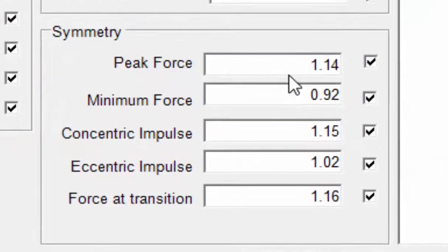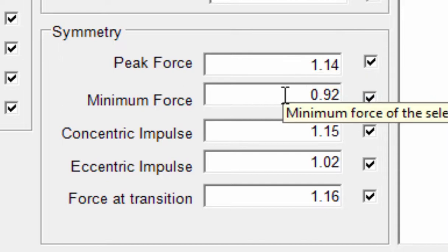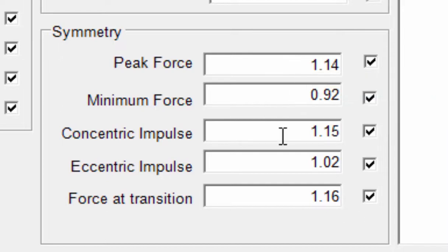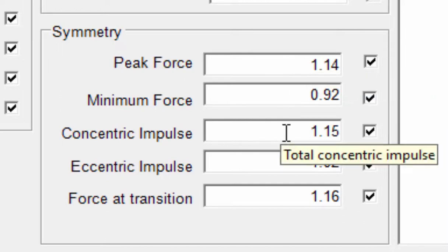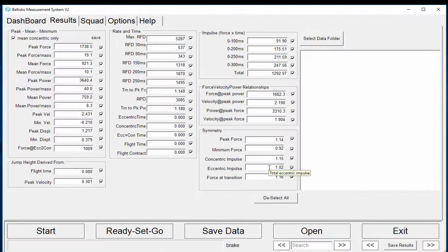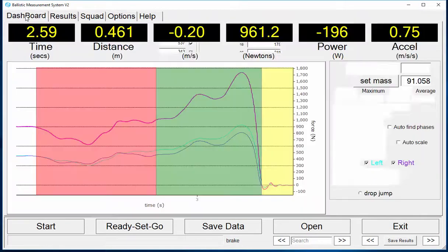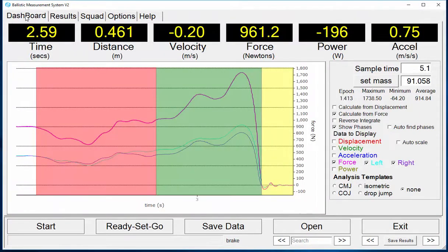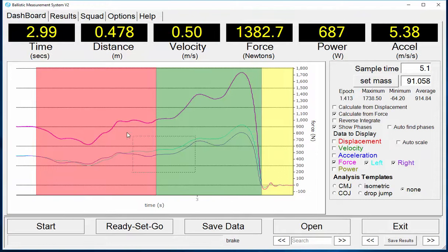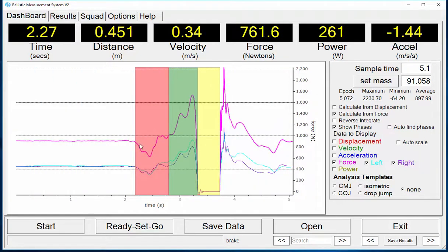Symmetry ratios left to right are calculated for peak force, minimum force, concentric impulse, eccentric impulse, and the force at the transition from eccentric to concentric. These parameters effectively quantify the observable differences in left to right force production.